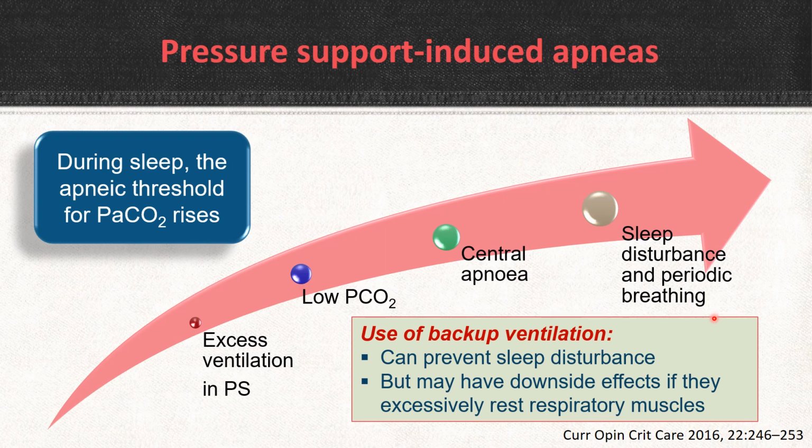So, pressure support can be adjusted and use of backup ventilation can help this sleep disturbance. But in backup ventilator, there will be less use of patient muscle. So, there may be a downside also.